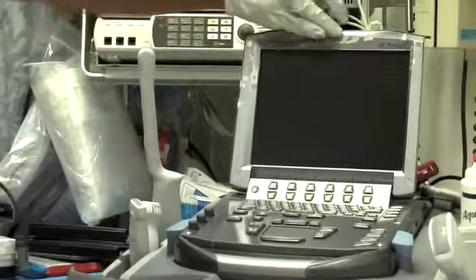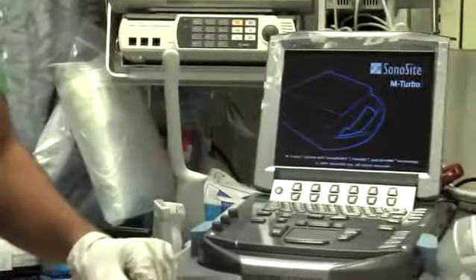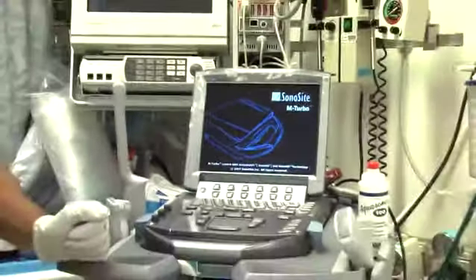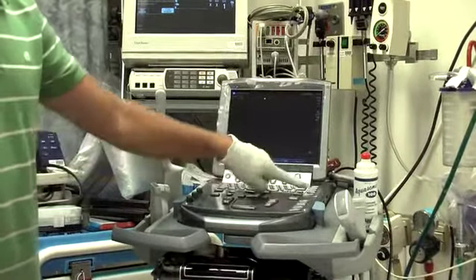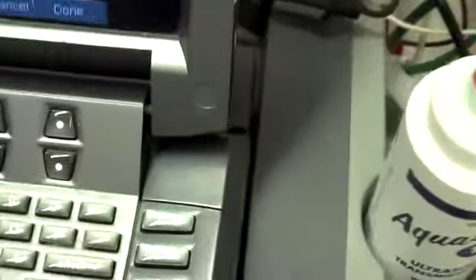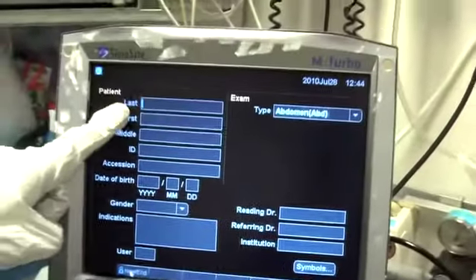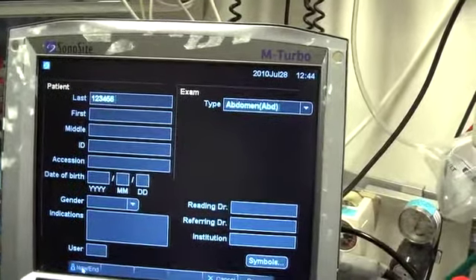So first things first, you have a patient that you want to scan. We're going to talk about how to get the machine set up to record so that it will be viewable in QA. So you boot up the machine with the power button, and then you hit this patient button. This gets you into the screen where you can input patient information. So you want to go to the new button, and you can hit this button, and it will clear this slot here. Then you'll punch in the patient's medical record number here, and then your assigned initials. I'm Brent Becker, so I'm BB, and whoever else might be.